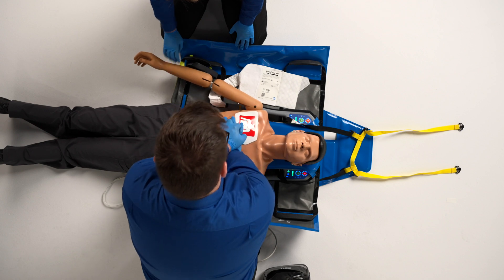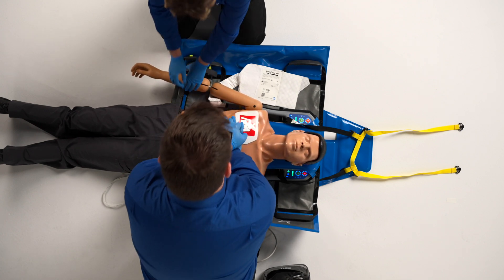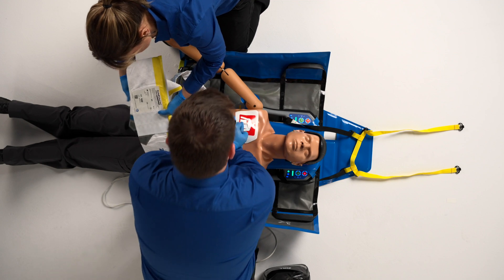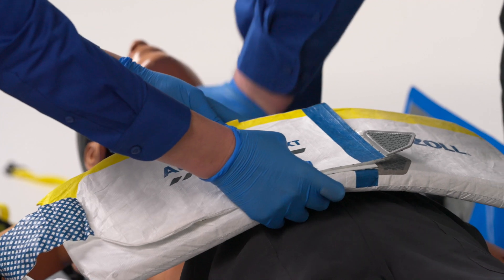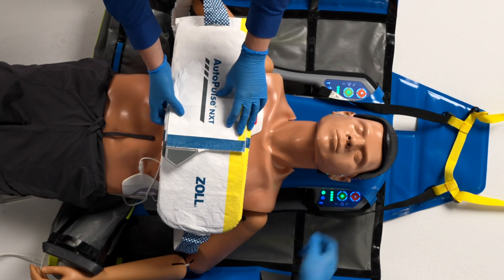Remember to take care to protect and guide the patient's head as it comes to rest on the platform. To secure the AutoPulse NXT band, first ensure that there are no twists. Place the short side on top of the long side, securing them with the Velcro. Line up the blue lines in the center of the patient's body and lay the AutoPulse NXT band across the patient's chest.